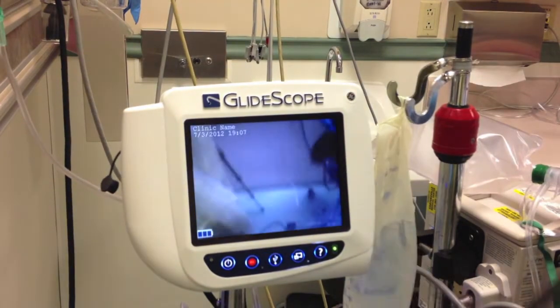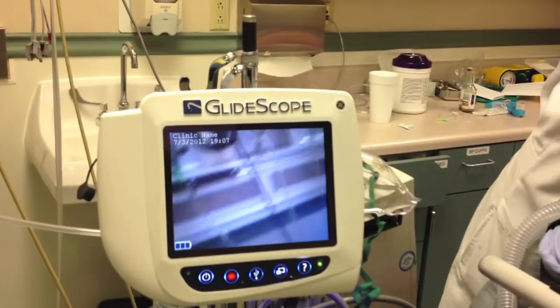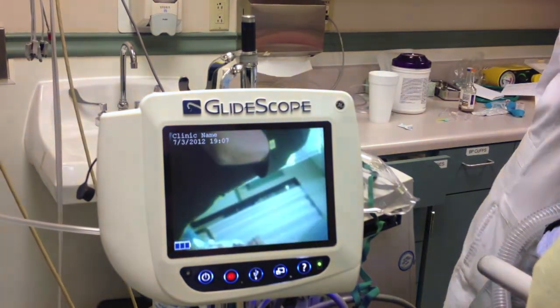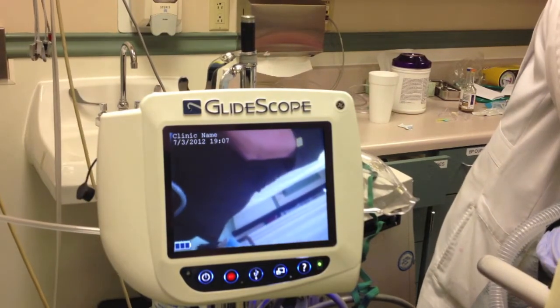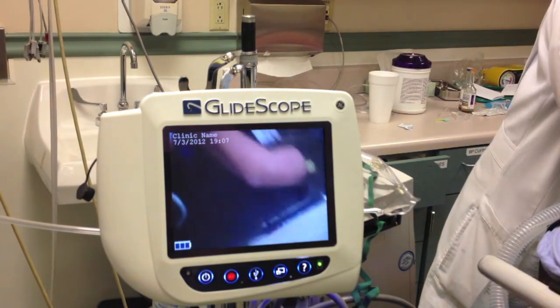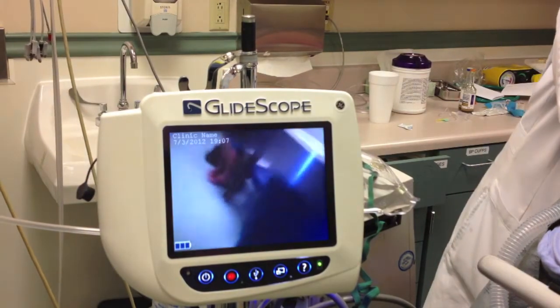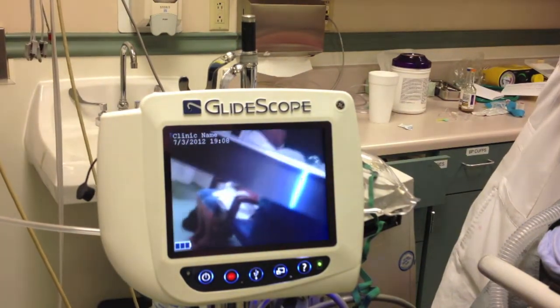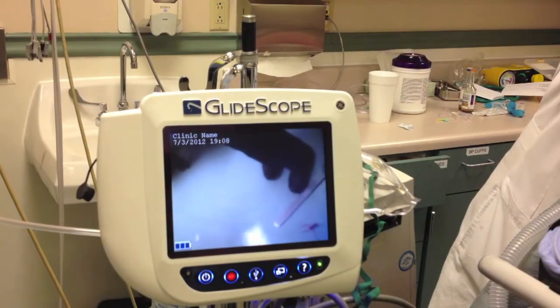The intubating laryngoscope has a curved blade — you can see it's plastic and curved, so it falls usually in between the tongue and the epiglottis. It's a lot less traumatic, requiring a lot less manipulation of the patient's neck. So when the patient is large in size, with a short chin and short neck, intubation is going to be difficult, and you definitely want to use an instrument like this.